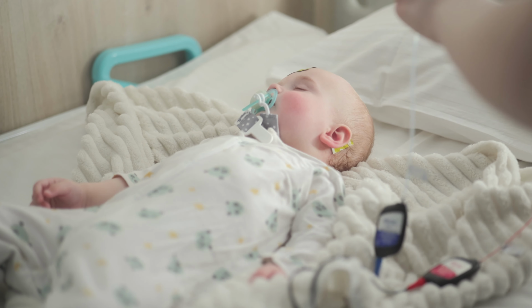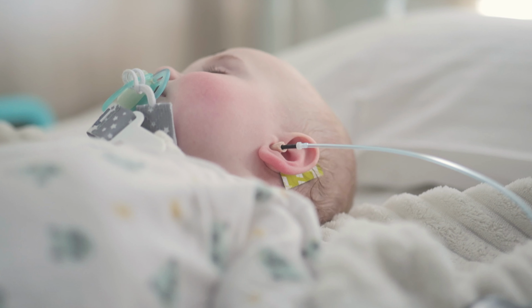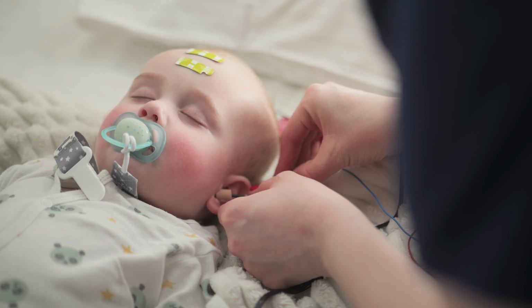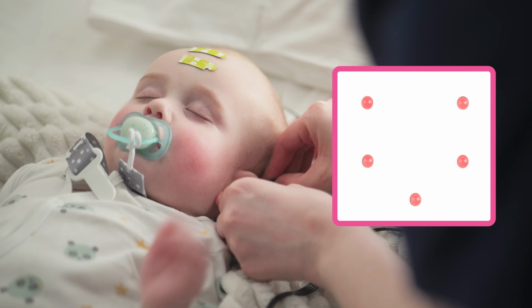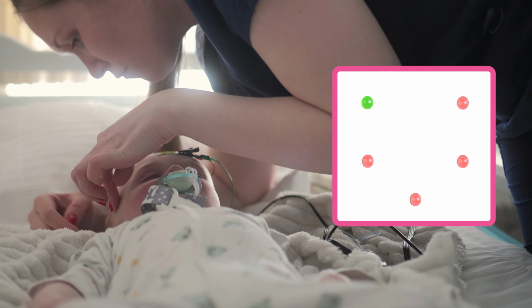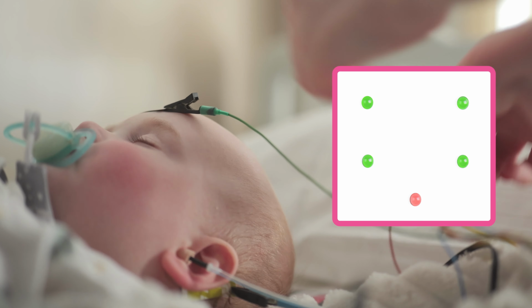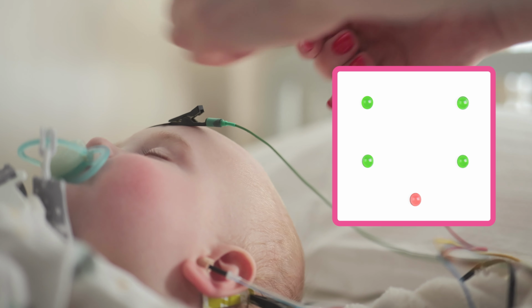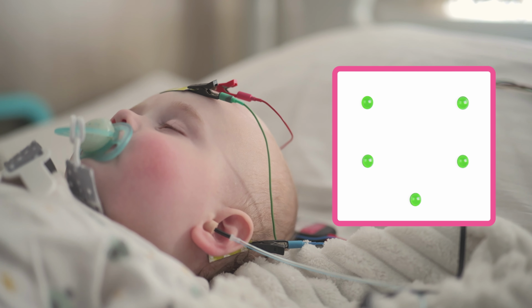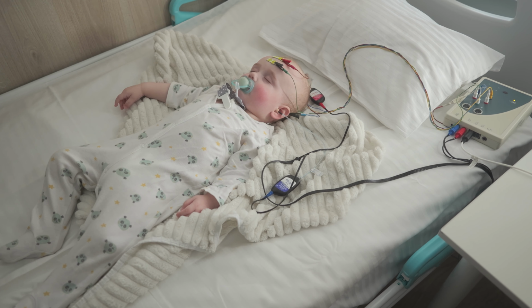The baby is asleep, and we insert the earphones into the ear canals. We insert the blue cable in the left ear and the red cable in the right ear. Then, using the alligator clips, we apply the electrodes to the ends of the hydrogel electrodes. The first channel, the minus to the left mastoid, and the second channel, the minus to the right mastoid, the ground is connected to the lower electrode near the bridge of the nose. The plus is attached through Y adapter to the upper electrode on the border with the scalp.